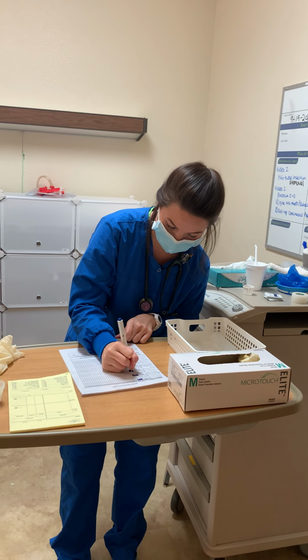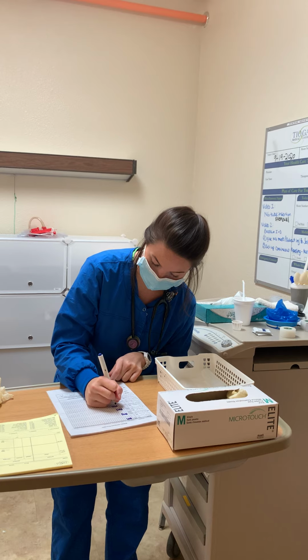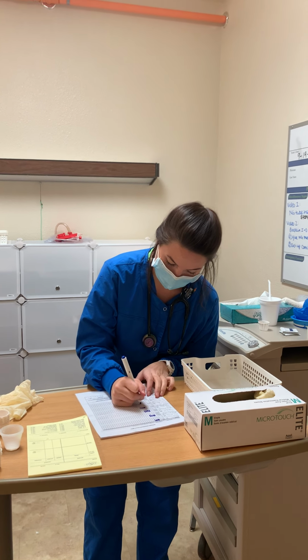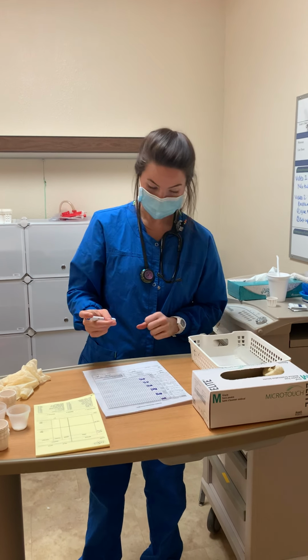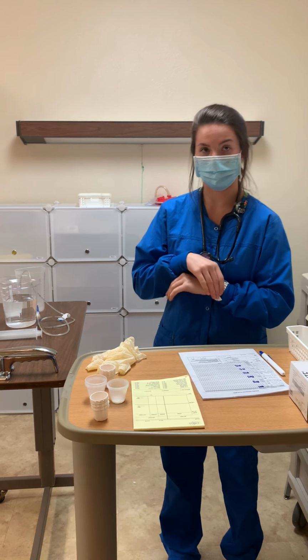I gave her Lasix. I did her Lovenox injection. I gave that in her stomach. Her Gevity is going right now at 40 mils an hour, and she was also flushed with sterile water. So now that my documentation was done, I would then clean up everything I needed to clean up, and that is it.